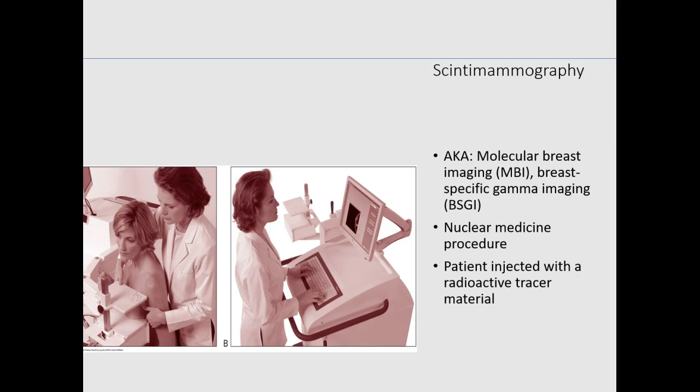Scintimammography is also called molecular breast imaging or breast-specific gamma imaging. It's a nuclear medicine procedure. The patient is injected with the radioactive tracer material, and then the uptake of the tumors in the breast are displayed via the nuclear medicine camera.